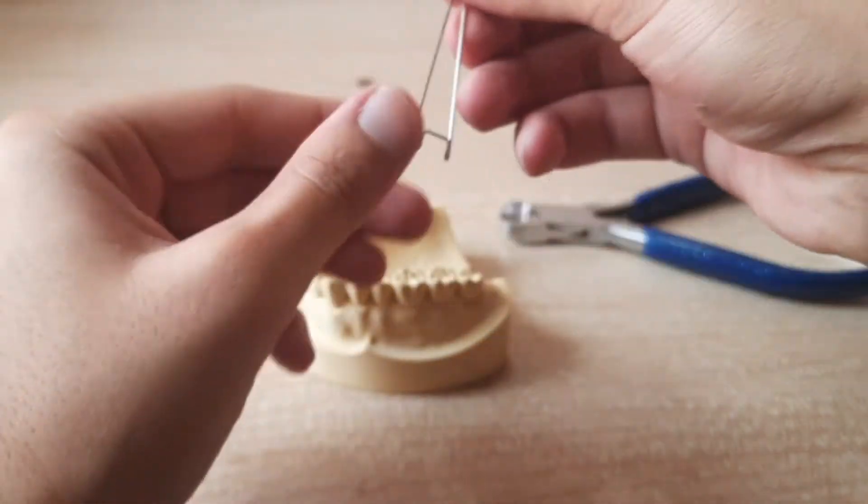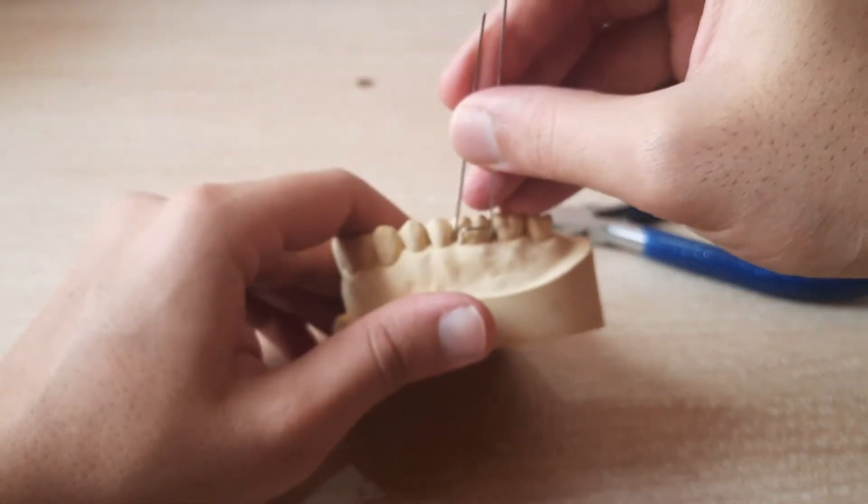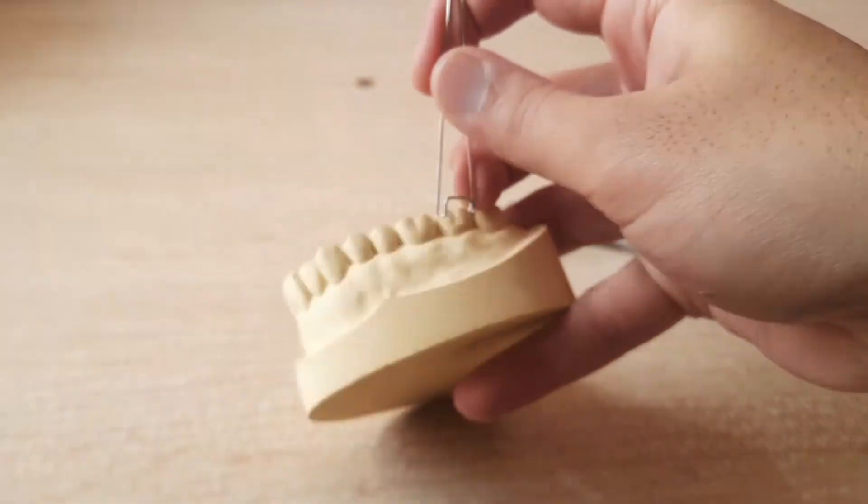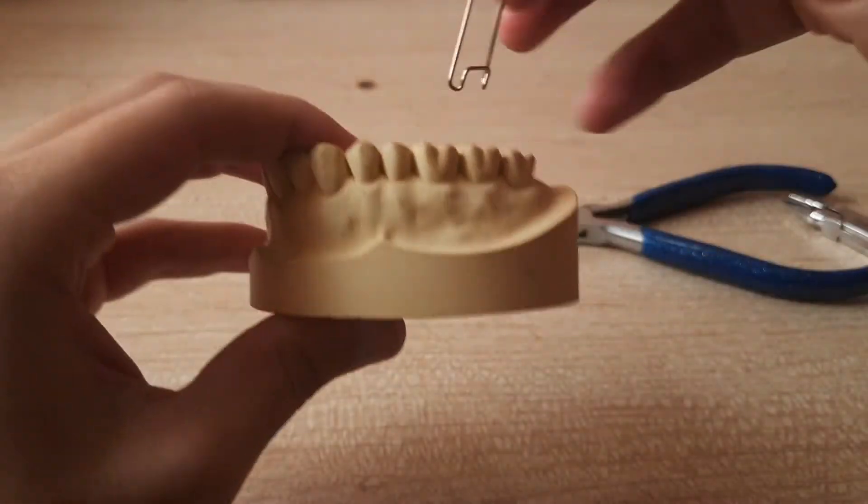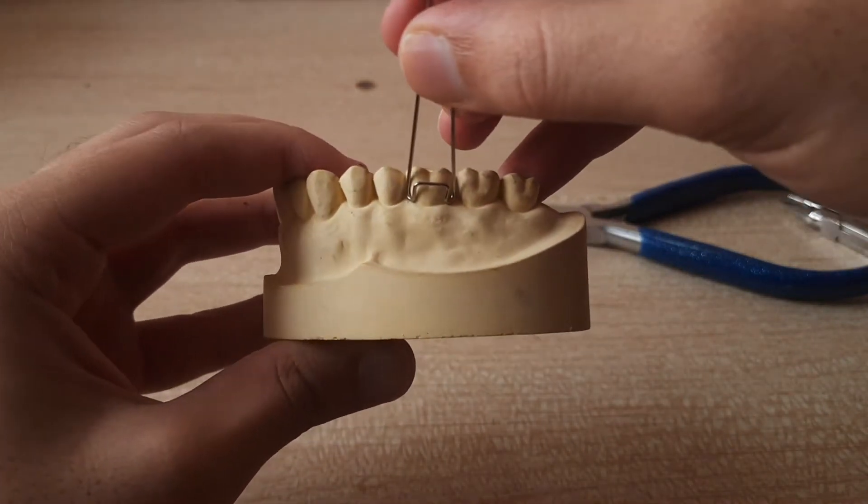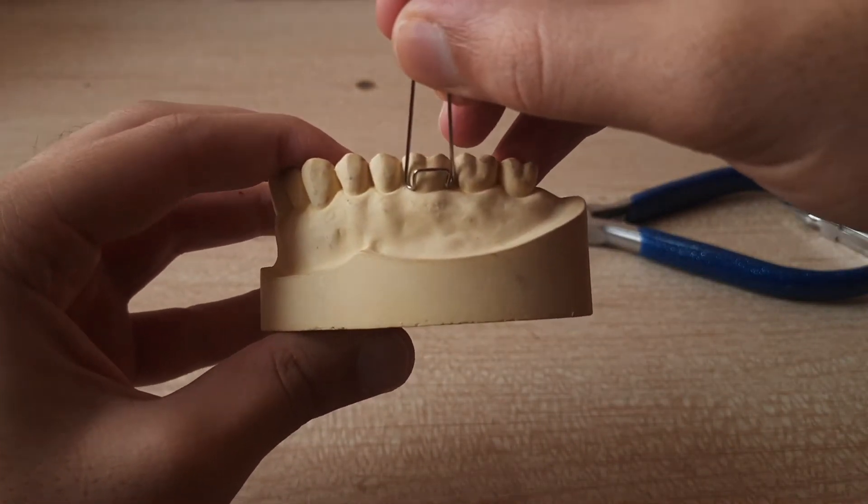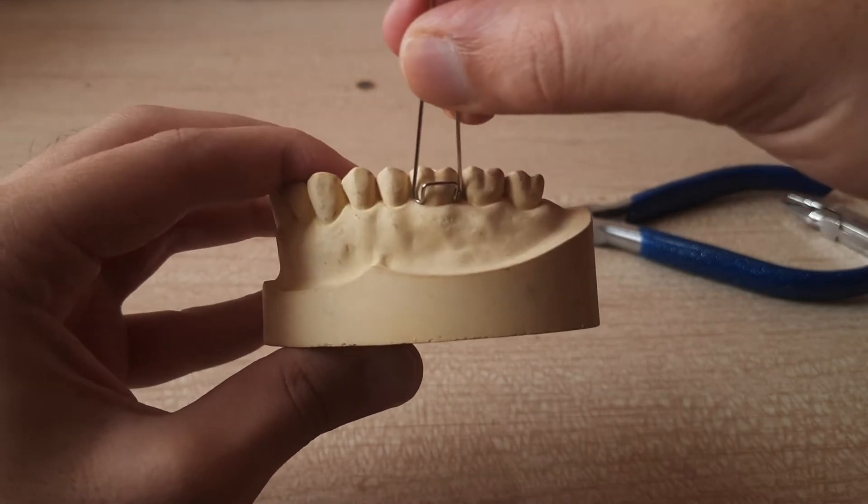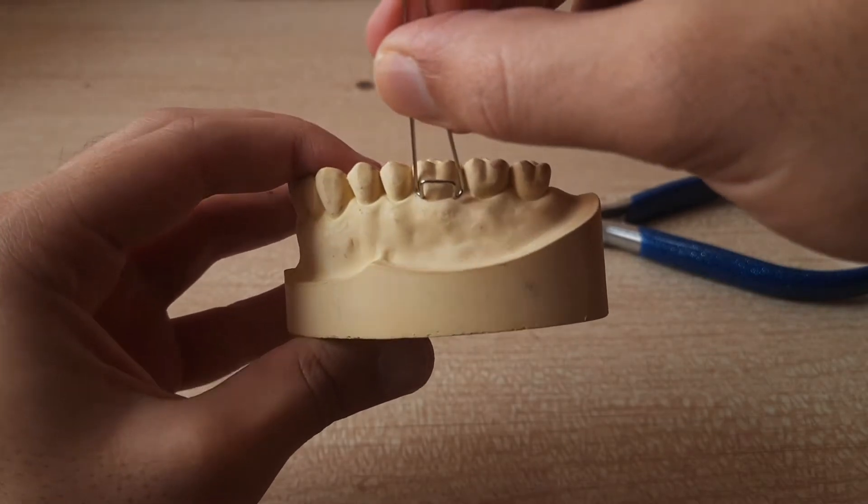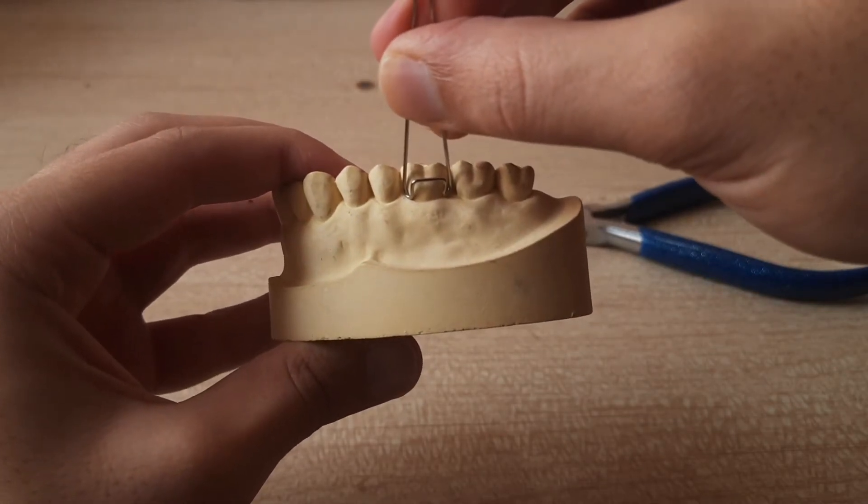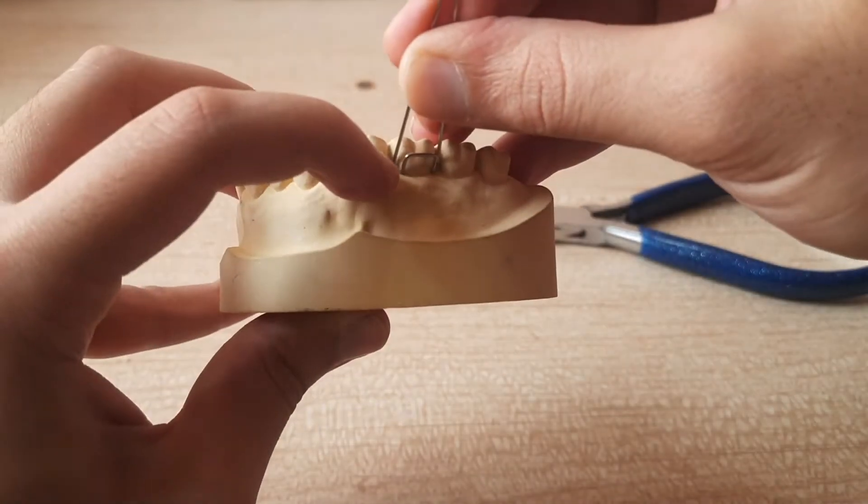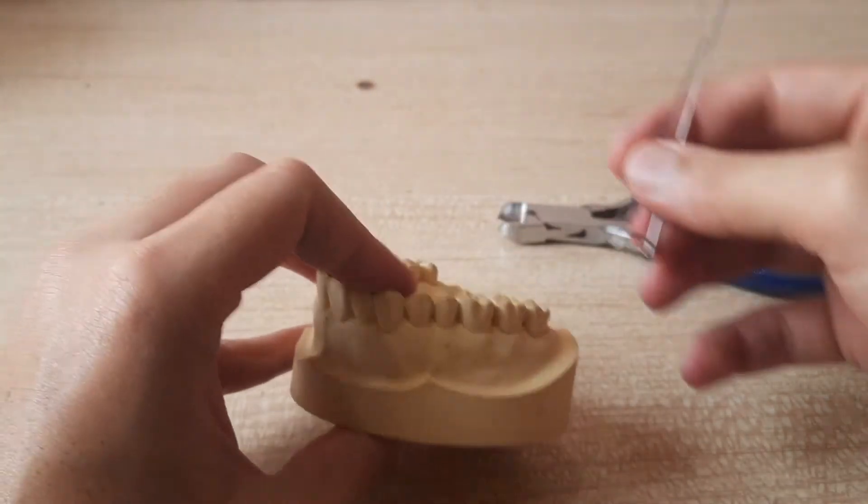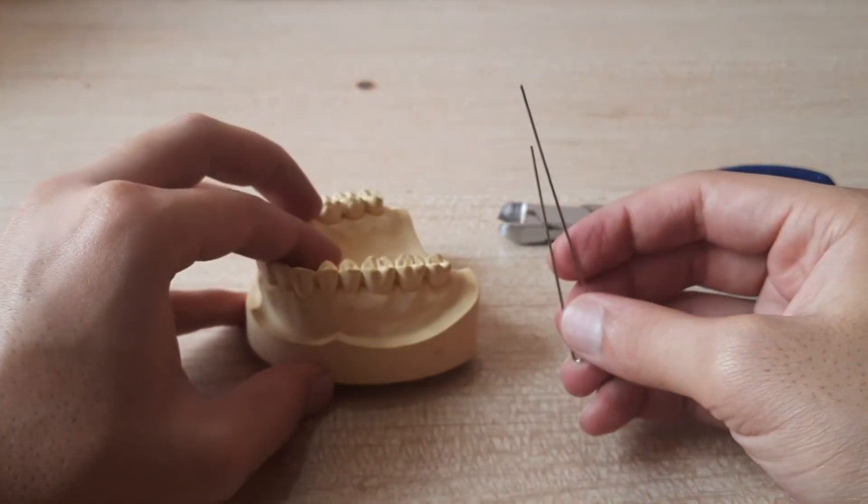Now we'll see how it looks on this thing. So you can clearly see that it is engaging. You can see that it is engaging into the mesio buccal and disto buccal undercuts and the bridge height is almost at the middle of the middle third. Now what you have to do is you have to make that million dollar bend on both sides.